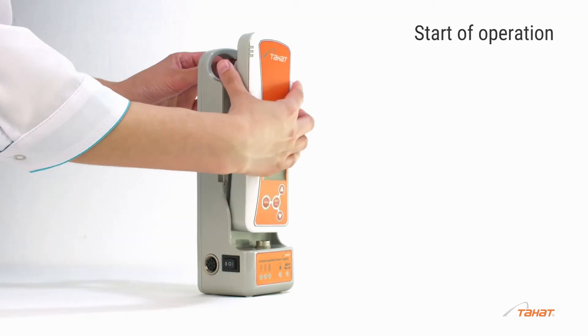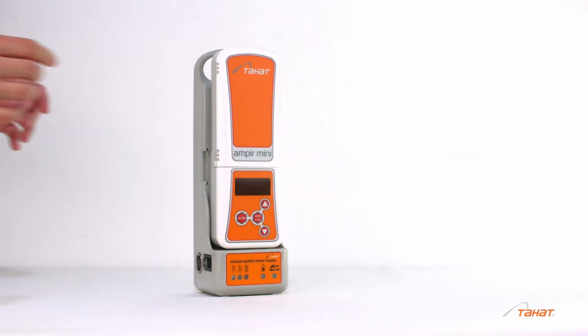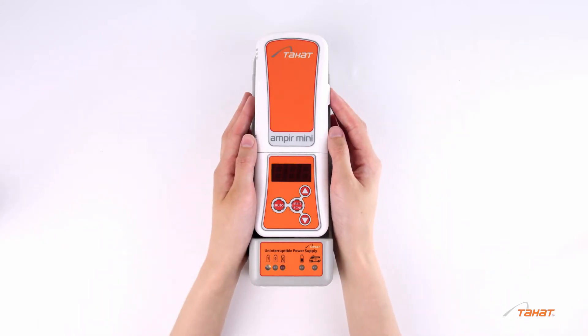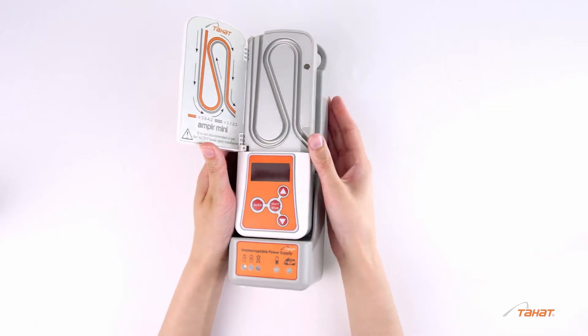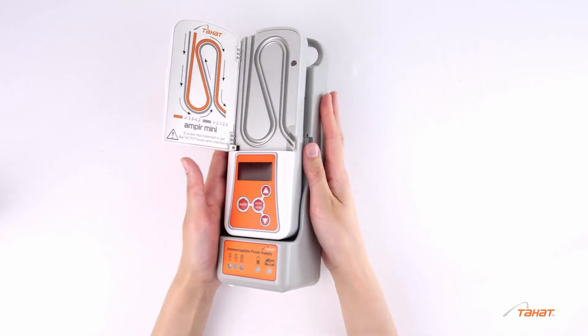Place the warming device vertically in the battery unit. Make sure that the power switch is in the off position. Open the heat exchanger cover and set the line according to the picture.